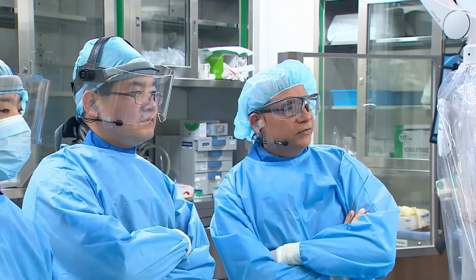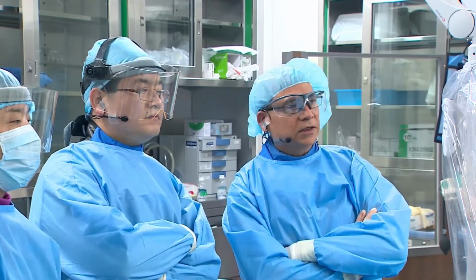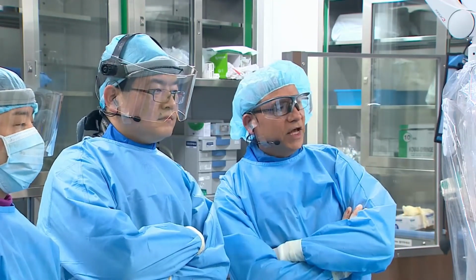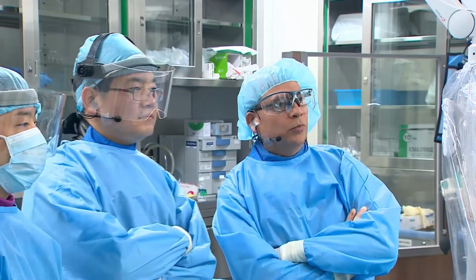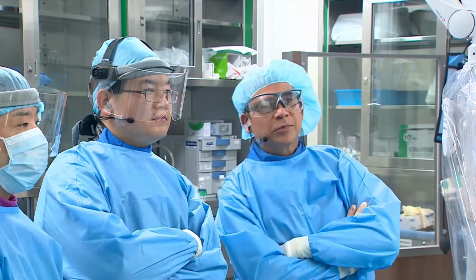And as the first speaker said, we were quite content once we had crossed the lesion to do a covered stent deployment of the common and the external. We did notice, as you did, that the common iliac on the right side has disease. We are hoping not to interfere with that today, but occasionally, as you are probably well aware, when you interfere with the common iliac on the left side, you can potentially compromise the right side, and you may end up having to do kissing stents. But that's not the original plan that we have in mind.